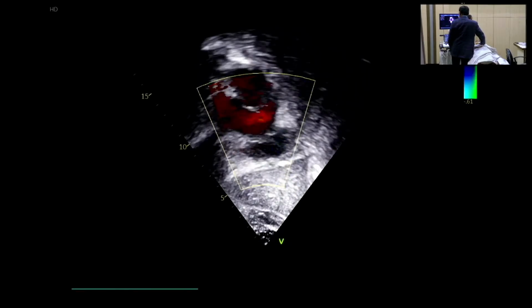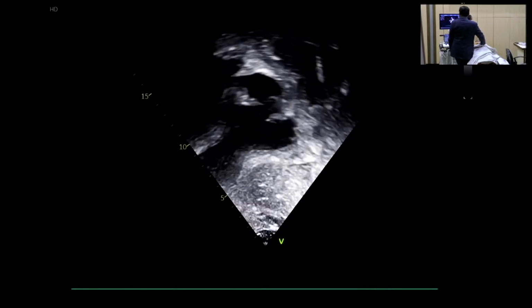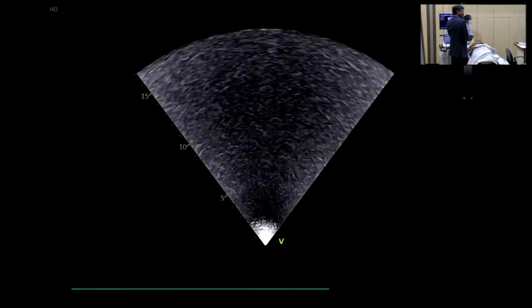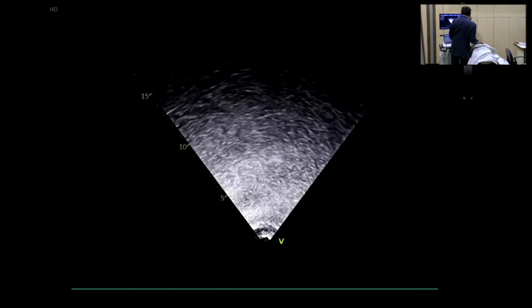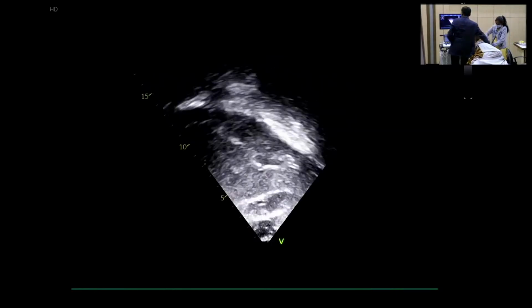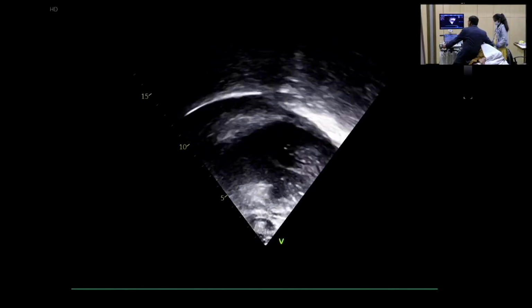Let's see. We should ask a simple question. So I am trying to see whether this patient has got coarctation of aorta or not. ड्रेस चेंज नहीं किया है, कैसे करेंगे सर? हो जाएगा, इधर कर लो, थोड़ा लेफ्ट टर्न, करवट ले लो, थोड़ा ड्रेस चेंज करो. So I will go to the four chamber view now. So what are the associated anomalies with coarct?